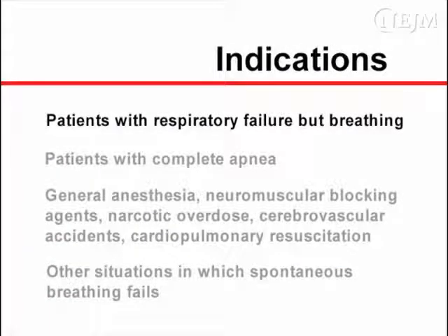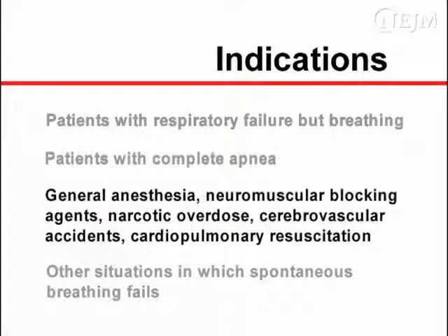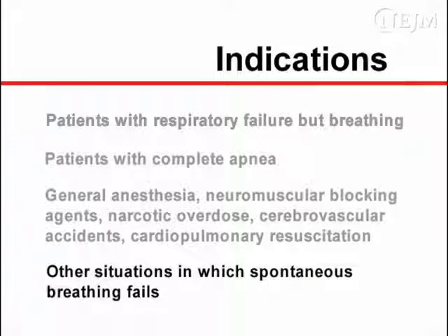Face mask ventilation is used in patients with respiratory failure who are still spontaneously breathing and in patients with complete apnea. Face mask ventilation can be indicated after the induction of general anesthesia, the administration of neuromuscular blocking agents, narcotic overdose, cerebrovascular accidents, cardiopulmonary resuscitation, and other situations in which spontaneous breathing is failing or completely ceases.